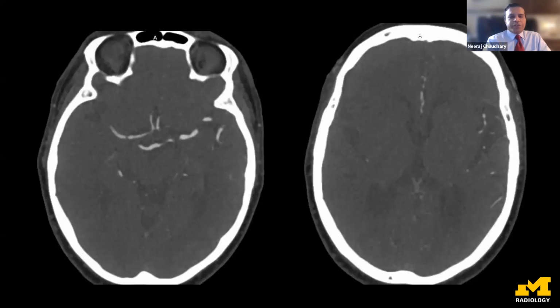So here we see the same patient where we had the fuzziness in the basal ganglia. This is the ICA terminus, the A1 segment of the anterior cerebral artery. This is the A2 segments bifurcating off towards the paramidline portions of the cerebral hemispheres. The middle cerebral artery is well perfused here on the left side, but it comes to a hard stop, as we see here on the right. So the insular dot sign is confirmed, yes, it is a large vessel occlusion, and the patient is favorable to undergo thrombectomy. If this patient was within 4.5 hours of onset of stroke, then no other imaging is needed. There's a little bit of debate whether perfusion, some centers do perfusion scans on every patient that comes in.